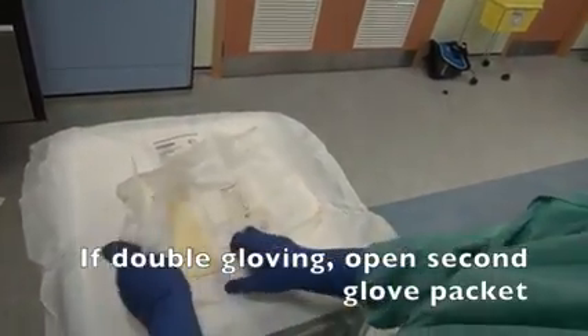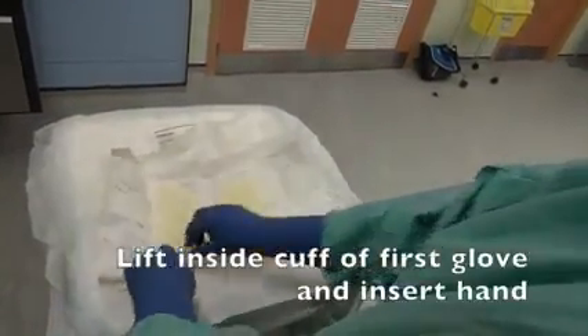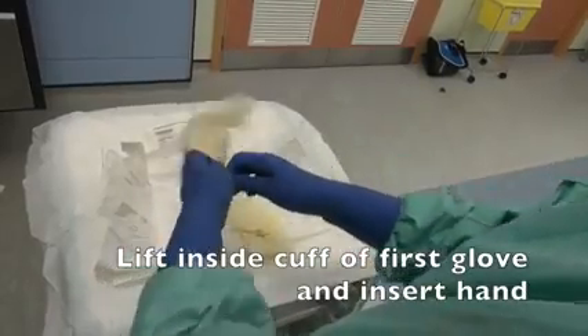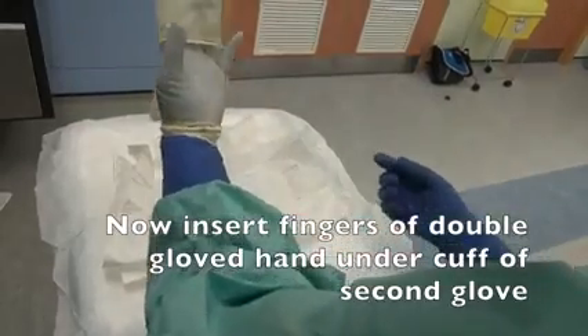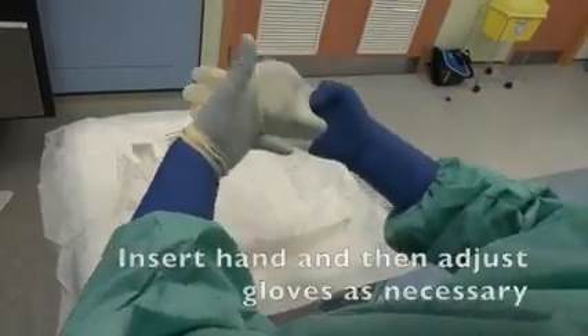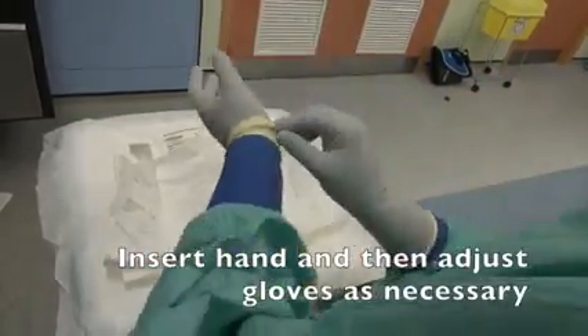If double gloving, open the second glove packet, lift the inside cuff of the first glove and insert hand. Now insert the fingers of the double gloved hand under the cuff of the second glove. Insert hand and then adjust gloves as necessary.